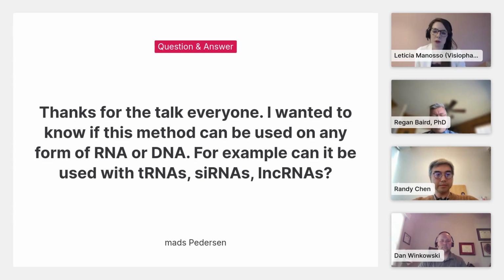I do have a question for you, Randy. What are the main advantages of the HCR platform compared to other ISH techniques? I see. So our technique is very sensitive due to the robust amplification of the HCR hairpins. And those hairpins are very small, so they can penetrate the tissues a lot better. As a result, we don't need protease digestion. And the technology is also faster and cheaper and more cost effective. All right, thank you.